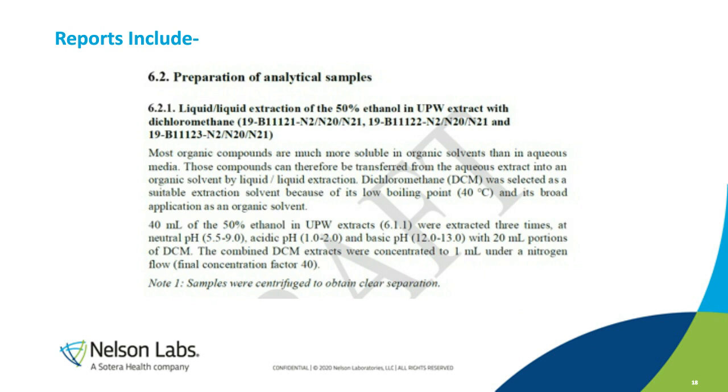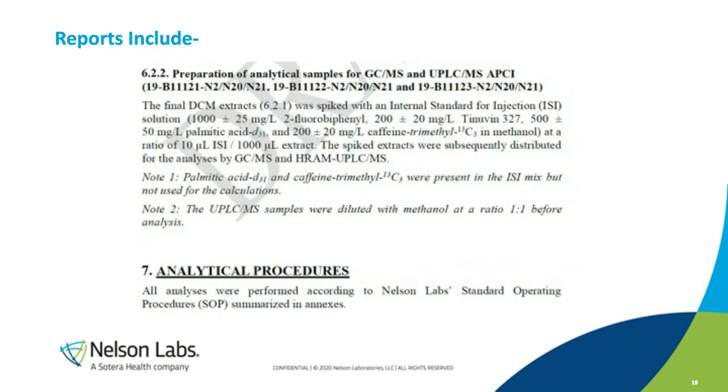Sample preparation of the analytical samples. I had another question from the FDA from a different lab where this was exactly the information that they were asking for that wasn't included in the report. So they want details about what internal standards were used, what surrogates were used, was there a liquid-liquid extraction, how did that work out, all of that stuff should be in there.